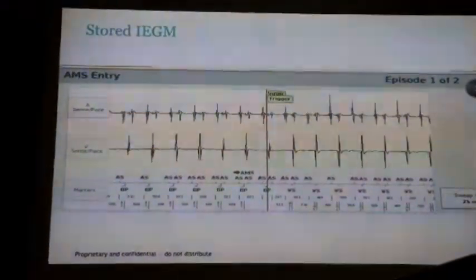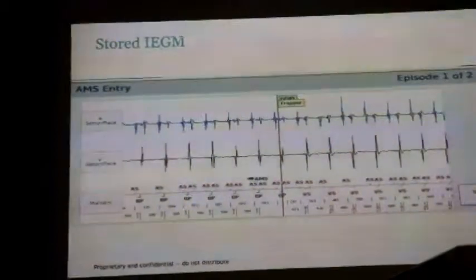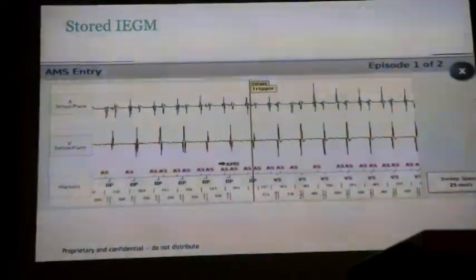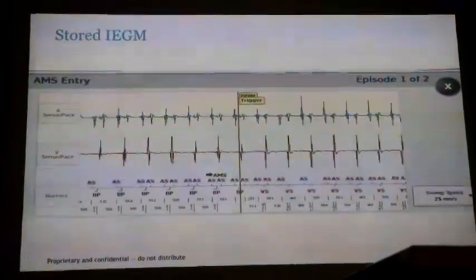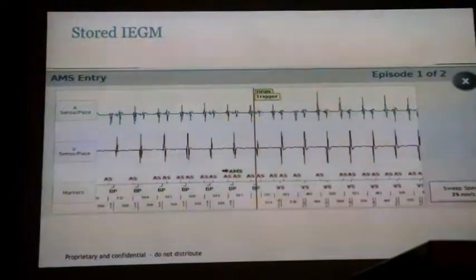We don't pay enough attention to these signals, especially like Dr. Murdoch said, when you pace them. And the other thing that can happen if you have far field R wave is you can lose CRT, and you can potentially get an inappropriate shock just from oversensing on the atrial lead. Because you'll see later on, it feeds wrong information into the SVT discrimination algorithm.